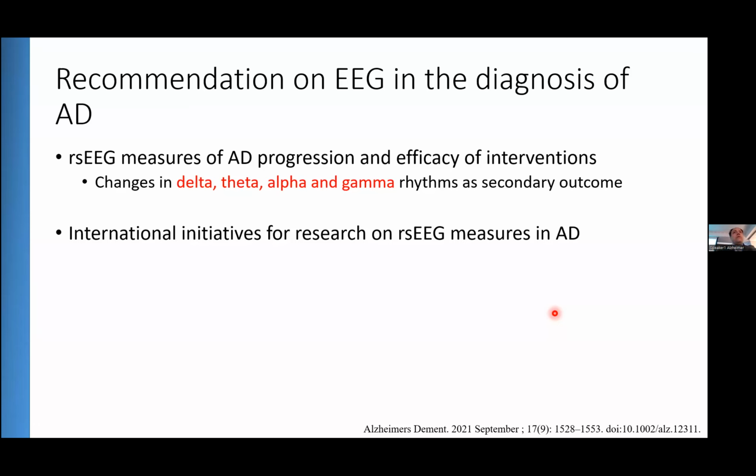What is also an interesting thought is that we could use those neurophysiological markers as a surrogate marker in clinical trials to reduce our costs and to find patients faster. For example, we can first use clinical criteria to introduce patients to the clinical trial, then proceed with the resting state EEG.